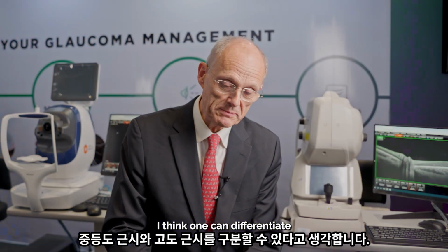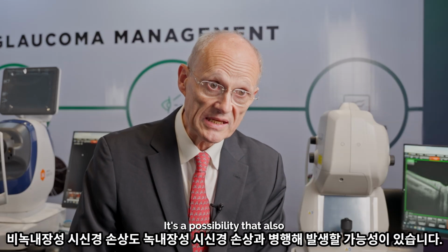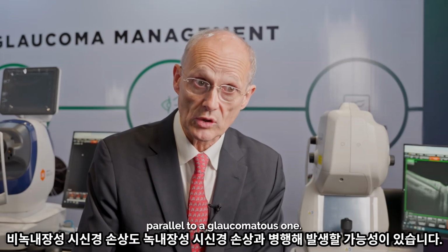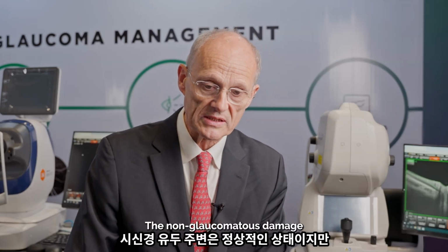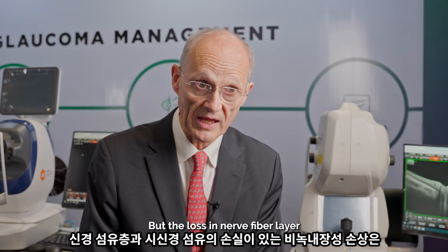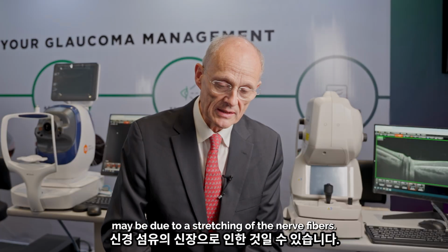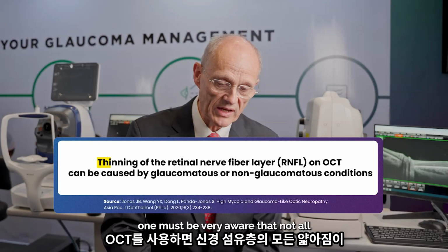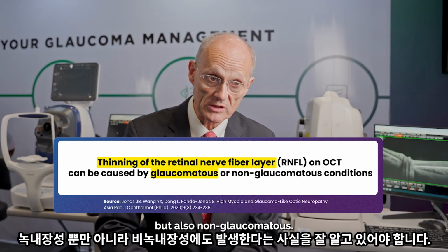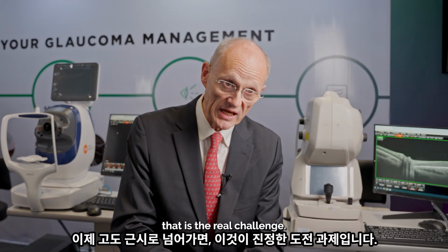I think one can differentiate between moderate myopia and high myopia. In moderate myopia, it's much easier. It's a possibility that also a non-glaucomatous optic nerve damage develops, parallel to a glaucomatous one. The non-glaucomatous damage with a normal configuration of the rim, but the loss in nerve fiber layer and optic nerve fibers, may be due to a stretching of the nerve fibers. With OCT, one must be very aware that not all thinning of the nerve fiber layer is glaucomatous, but also non-glaucomatous. Now, if you go to high myopia, that is the real challenge.